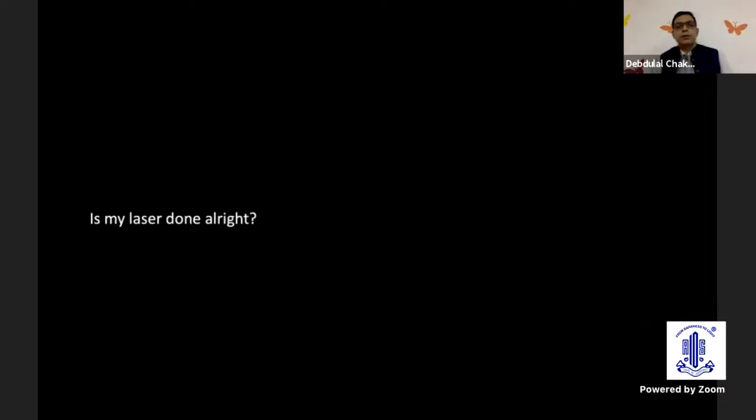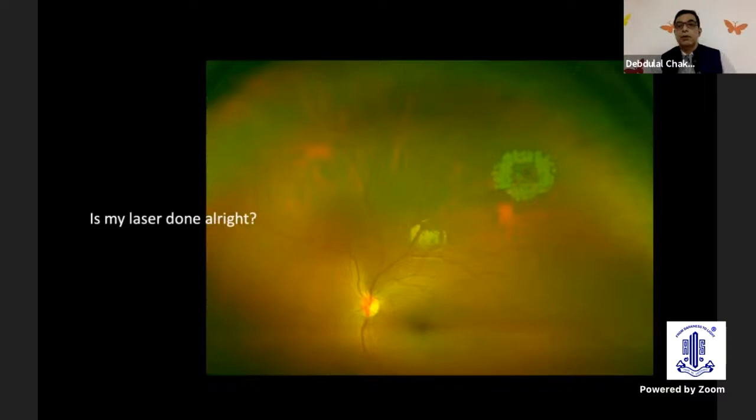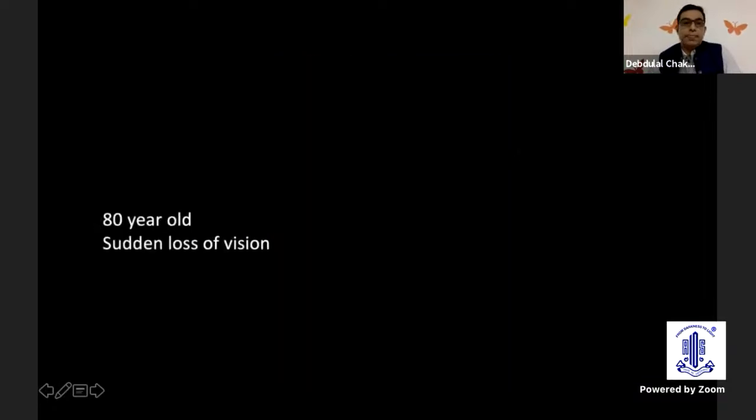So there are a lot of patients who come to me asking whether my laser has been done all right. So the Optos says it all. And you can tell and save a colleague from other issues and say, showing that the laser has been done all right.